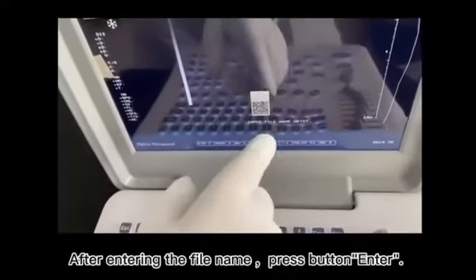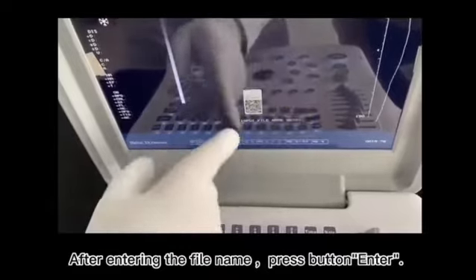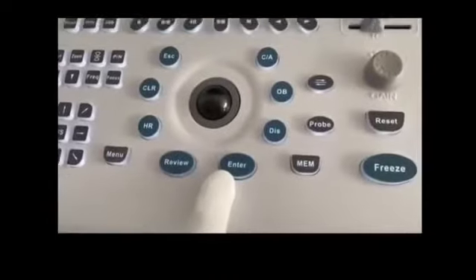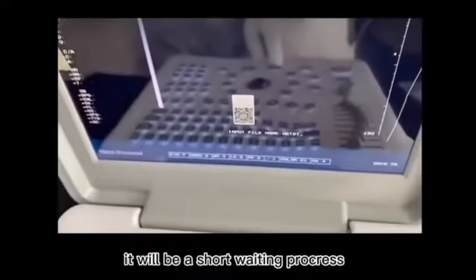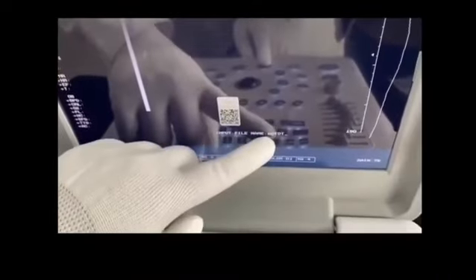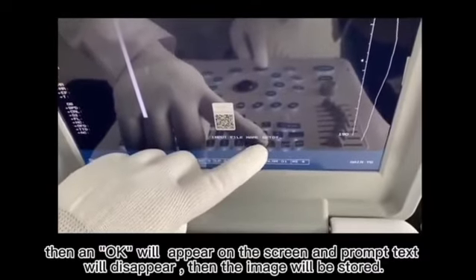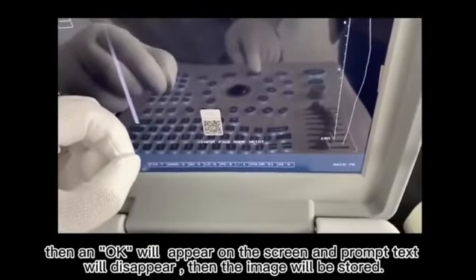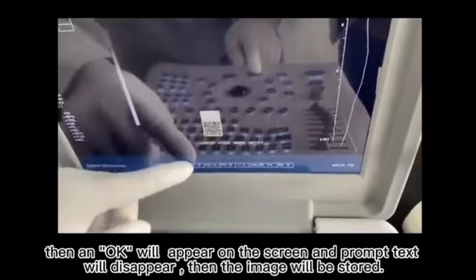After entering the file name, press the Enter button. There will be a short waiting progress. Then an OK will appear on the screen and the prompt text will disappear, and the image will be stored.